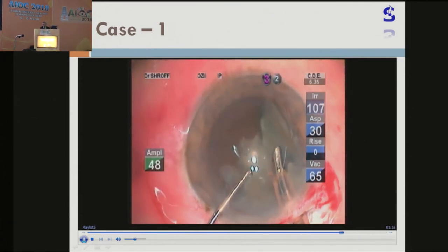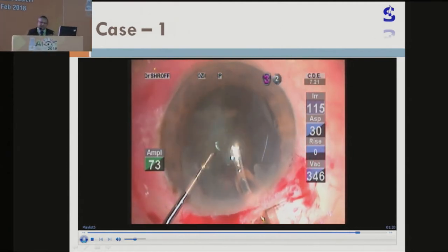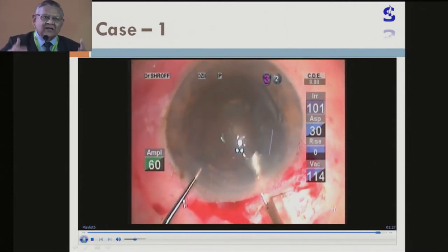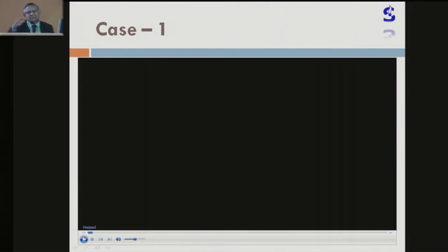It depends upon the size and the density of the nucleus. You can go for four pieces, five pieces, six pieces — it depends. Moreover, it's not necessary that it will be straight, vertical, or horizontal chopping. It can be in a different haphazard manner, but still you can do it.